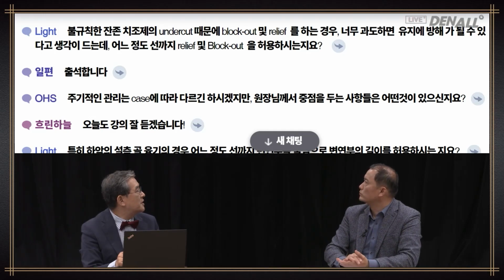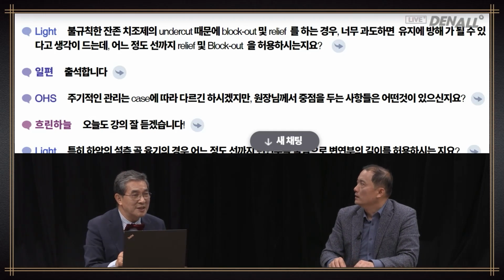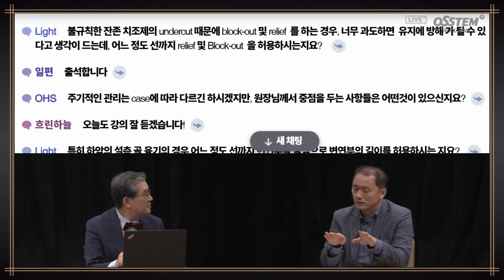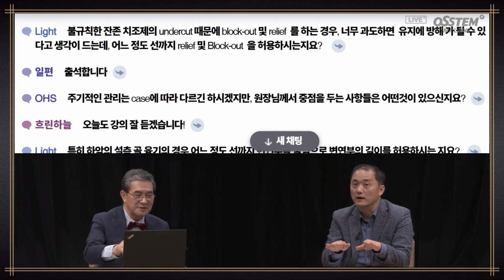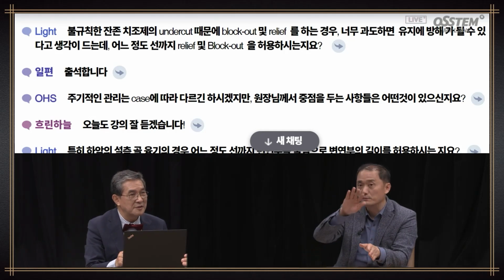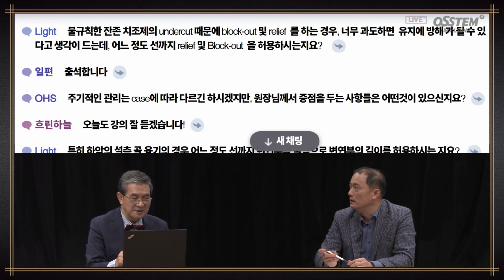And then another question: because of the irregular residual alveolar ridge, if you have an undercut and you do block out and relief, it could hinder retention. So how much do you allow for the relief and block out? Well, that's a bit of a vague question. You have to make a clinical decision. Like if there is an undercut and the insertion happens vertically, there is a hindrance, then you have to remove it. But if you insert at an angle, one side first and the other side later, sometimes it's resolved.